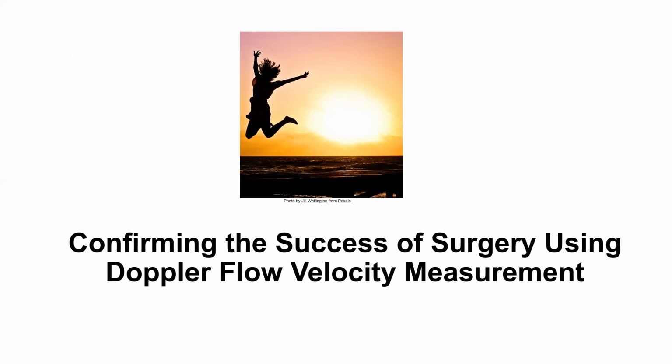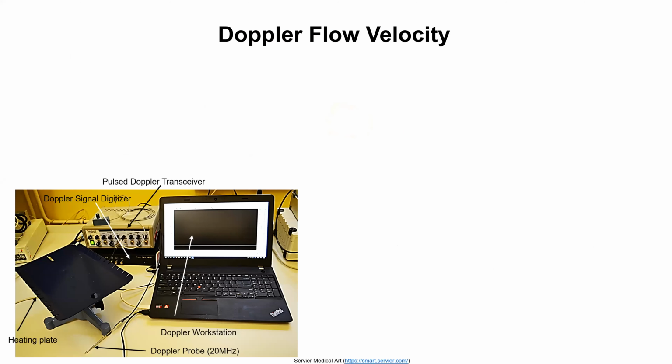So before you jump for happiness that your surgery worked, you need to confirm the surgery's success with Doppler flow velocity measurements. For this purpose, you need a Doppler flow velocity device, consisting of a Doppler probe. I'm using a 20 megahertz probe, and the Doppler transceiver, digitizer, and a laptop showing your Doppler workstation, a heating plate, and pre-warmed ultrasound gel.